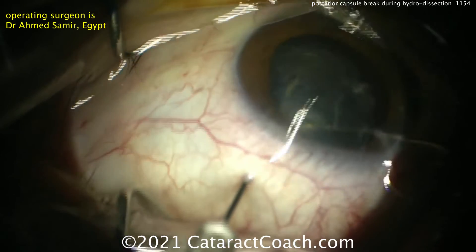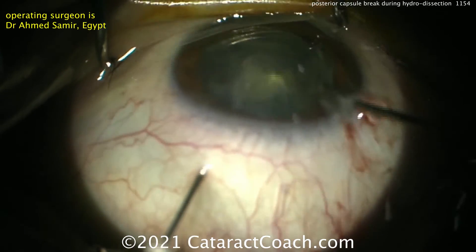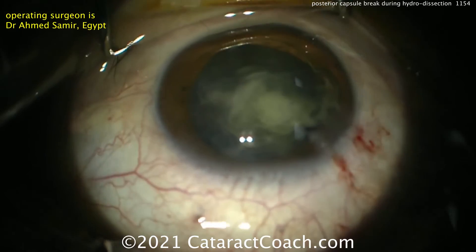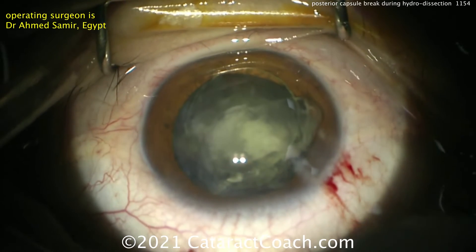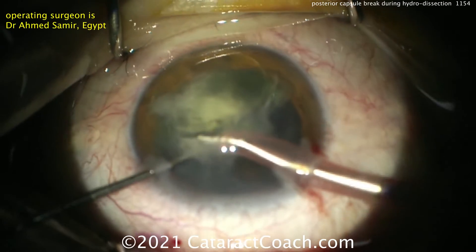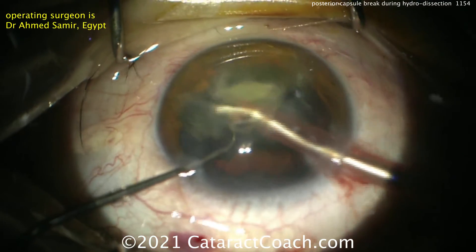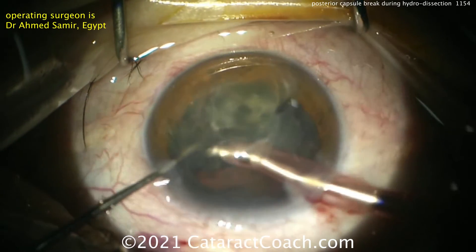It's been described for many years in the literature and the nucleus can be brought up here. For me, this is a high-risk procedure. What I'd advocate instead is: if the nucleus is already falling into the vitreous cavity and you have a vitreoretinal colleague who can help you, let the nucleus go back into the vitreous cavity. Your colleague can then perform a full pars plana vitrectomy and pars plana lensectomy, and it'll have a beautiful outcome.